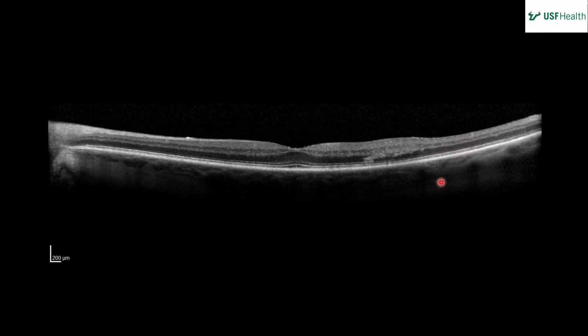Oh, okay. I can't really see how far it's extending, but you see a hyperreflective area in the para... Did you just call that parafoveal? That would be... or is it too far out? It's a wider image than I normally see. That would probably be perifoveal. Okay. I have to go back to one. Hyperreflective area that corresponds most likely with the area of intraretinal hemorrhages that we saw.